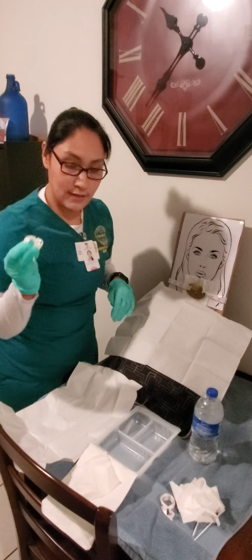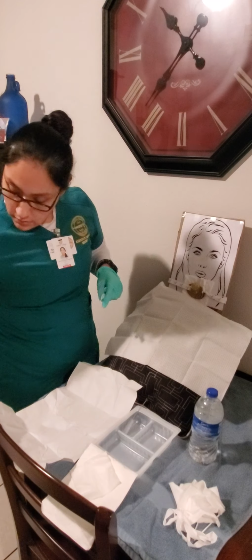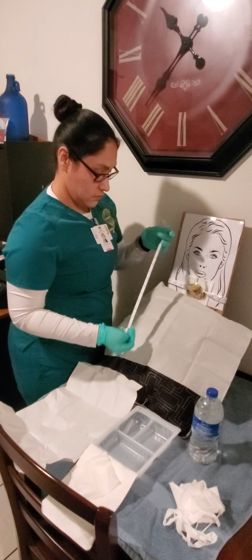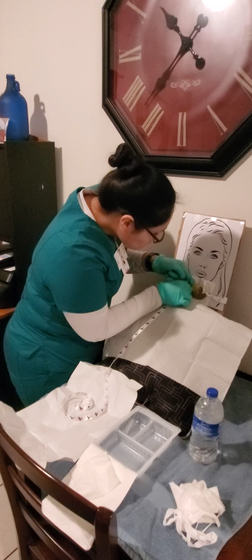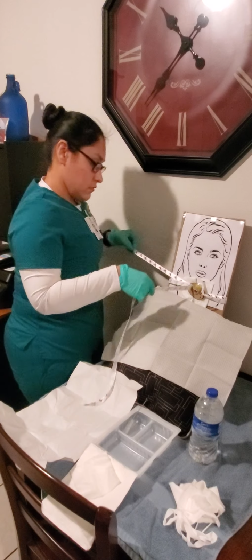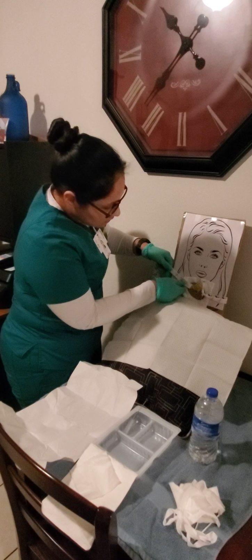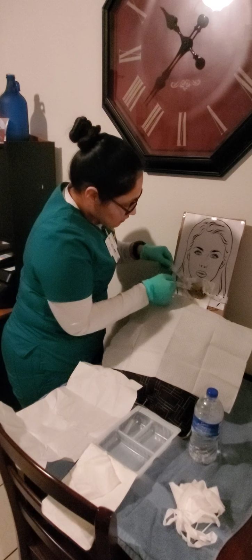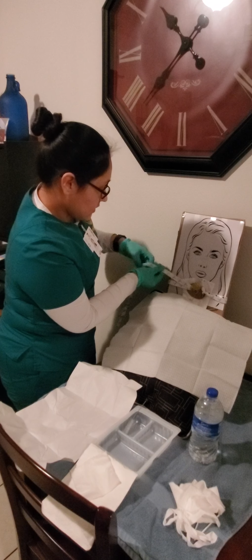So I'm gonna use, they provided me with this one, but I'm gonna go ahead and use my ribbon. This is gonna go around the patient's neck.